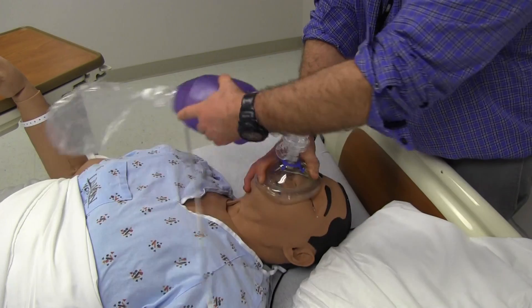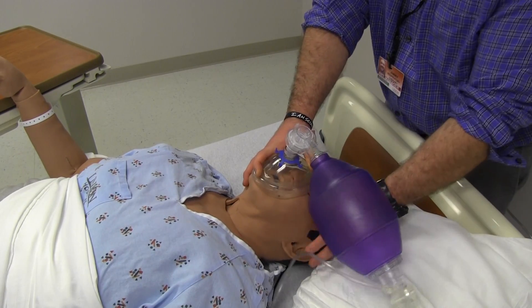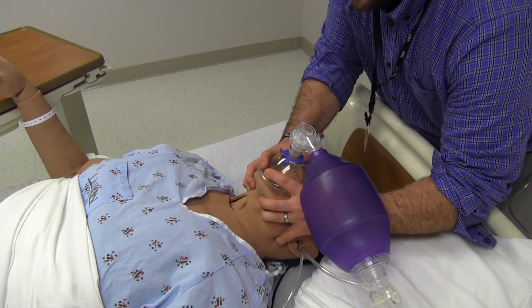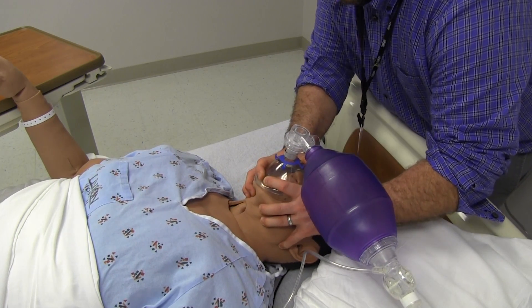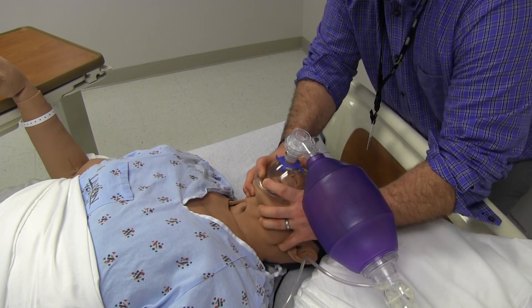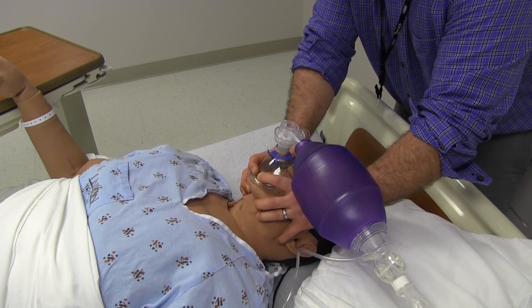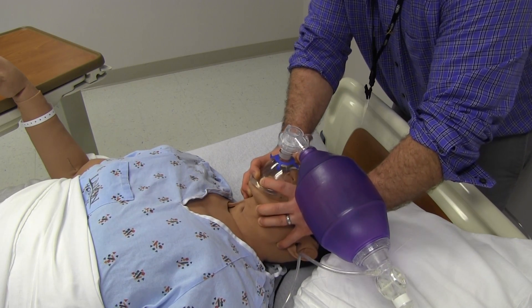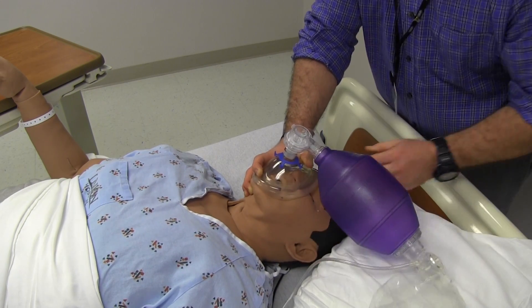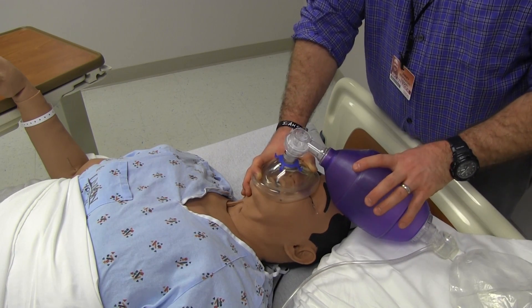The great thing about the bag valve mask is it can go to either side — left-handed, right-handed, whatever you need. A lot of times if we're having trouble, we'll do a dual method with a C and E on both sides, then employ a respiratory therapist or nurse helper to actually ventilate while we seal the mask. This is temporary — we don't want to do this for a long period of time. We need to put in an oral airway, nasopharyngeal airway, or an endotracheal tube as an advanced airway. So next I'm going to show you OP airways, NP airways, how to measure, and how to insert.